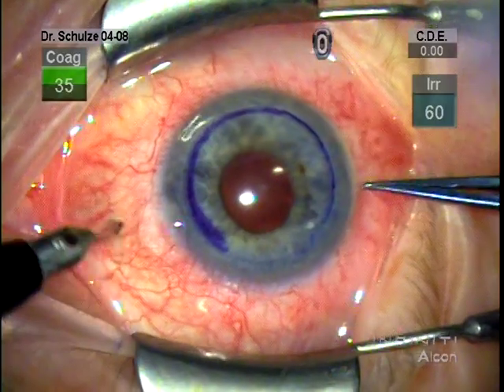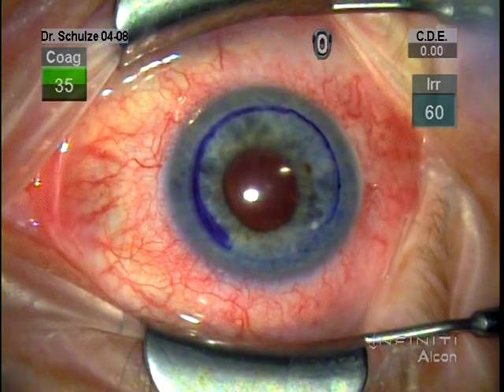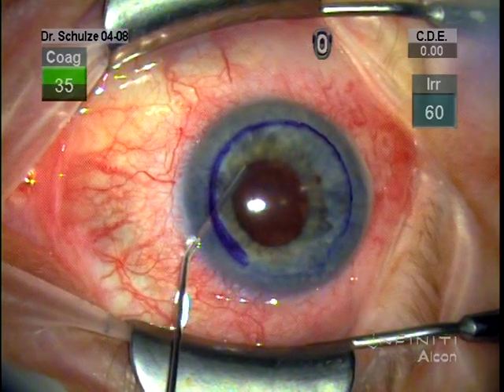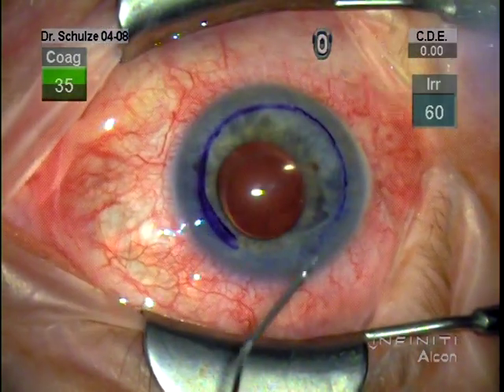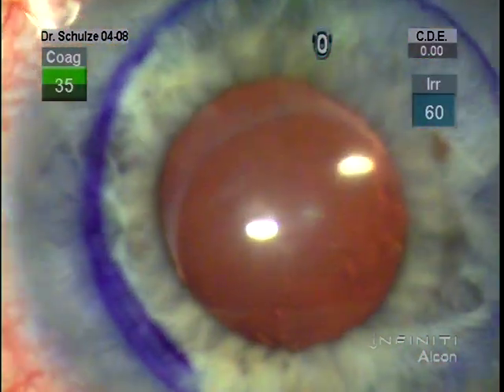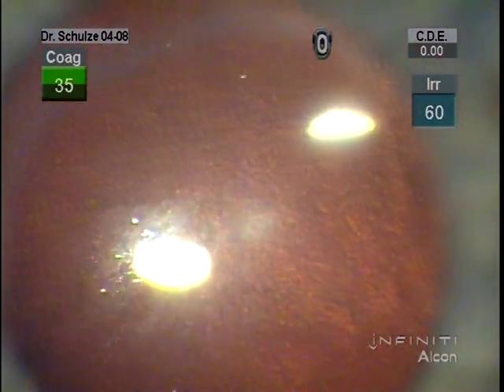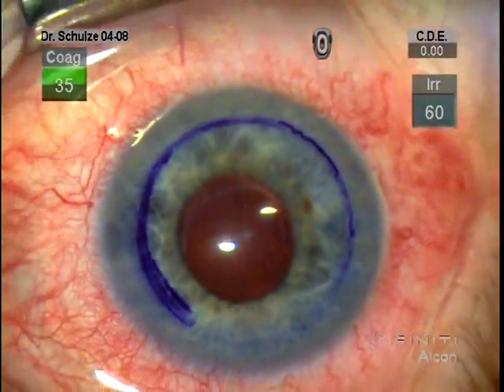I make a couple of side ports to aid in positioning the donor. These side ports are made with a fairly vertical entry to the cornea rather than parallel to the iris as you would with cataract surgery. The vertical entry allows me to enter the anterior chamber with other instruments without dislodging the margin of the donor. I've just instilled some Healon into the anterior chamber to keep it formed while we strip Descemet's. I've also zoomed in on the endothelium to demonstrate the fairly significant guttata that you can see here.